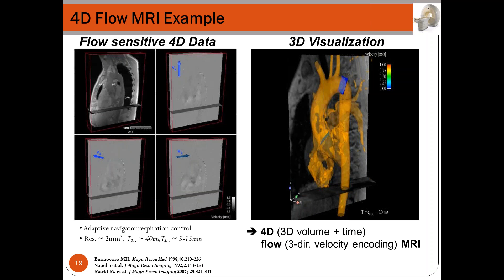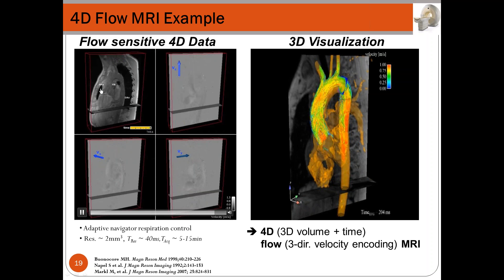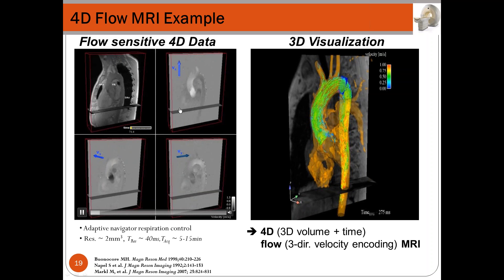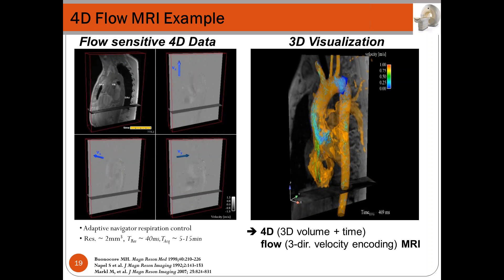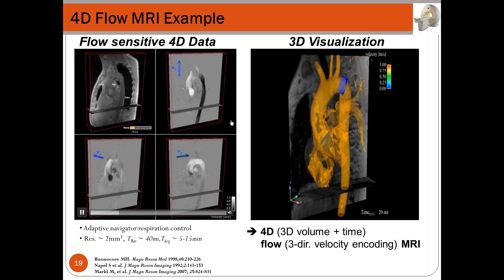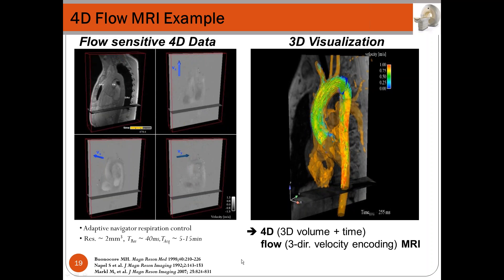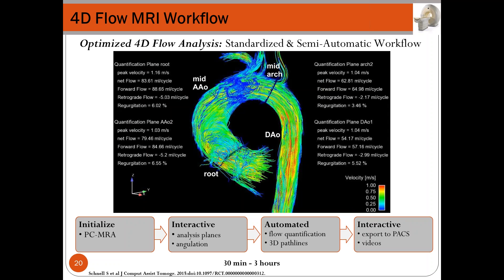However, the results are very good after completing all that work. Here is an example for a healthy control with 2 mm spatial resolution, 40 ms temporal resolution, and acquisition time of 5 to 15 minutes. We have a large amount of data with these acquisitions, so the best way to visualize information is using dedicated software for streamlines and pathlines. Here you can see an animation of particle traces along the cardiac cycle.